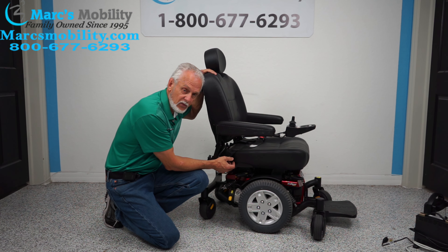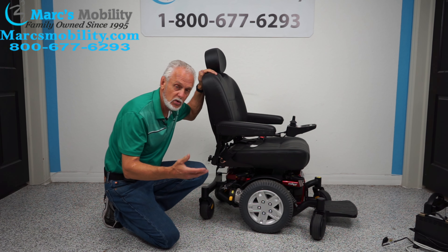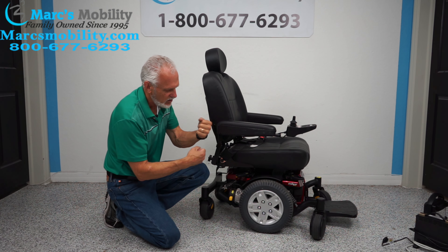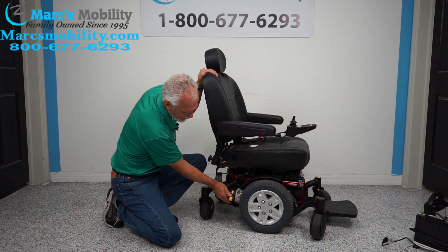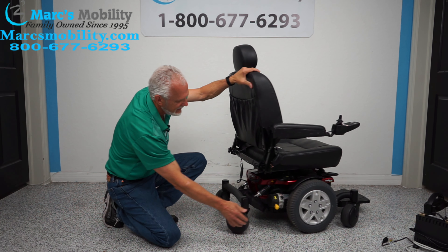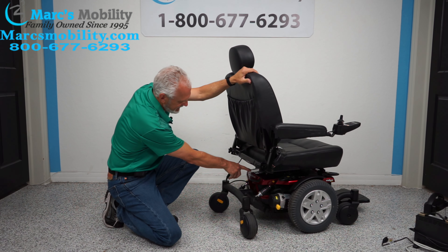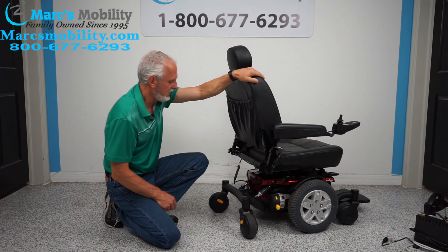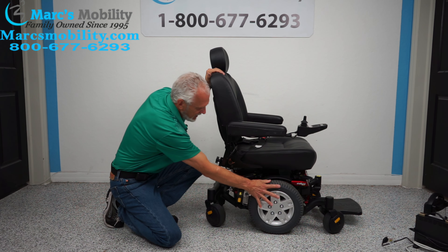These are the HD motors — they're heavy duty motors. This chair probably weighs 300 pounds right now. If you had to move it for some reason — you forgot to charge it, you have an issue with the chair — turn the power off, because you want no resistance in these motors. With the power off you won't have that. You see the yellow handles: push them down and now you can roll the chair. You have to do both motors on both sides. The factory sticker says 336 pounds. Put it back in gear when you're done, motor back up, and you're back in gear.